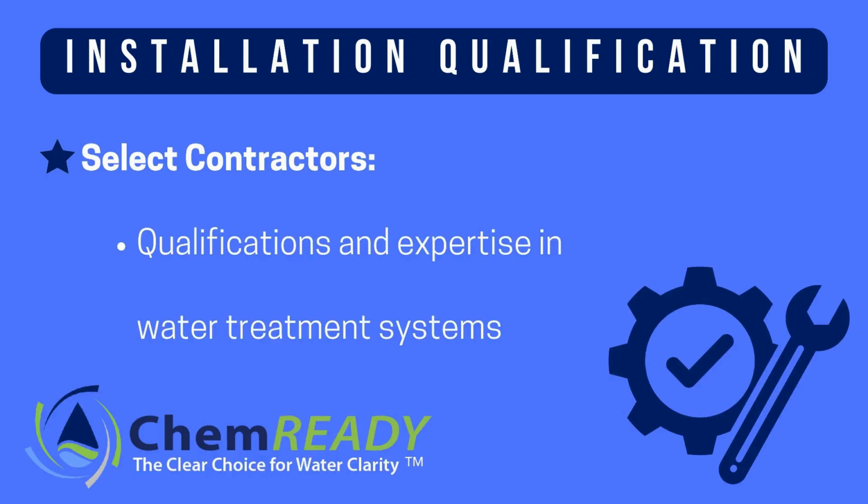It's essential to choose contractors who not only have experience in water treatment systems, but also understand the specific requirements for medical device processing environments. By investing time in finding the right experts, you can minimize installation issues and ensure that your system is set up for optimal performance from the start.